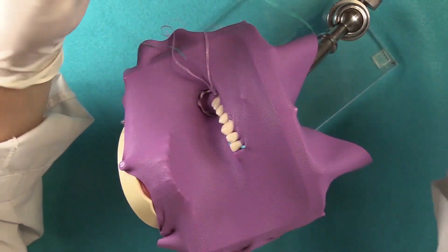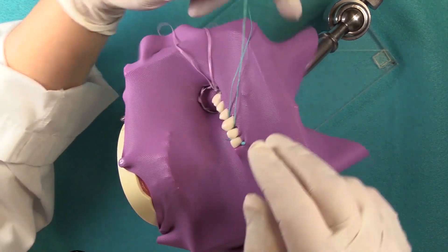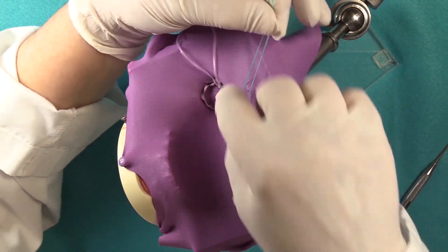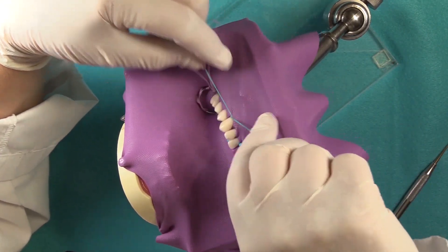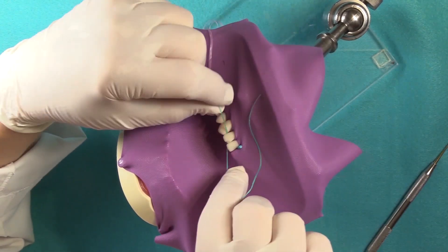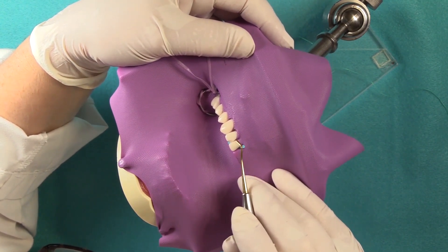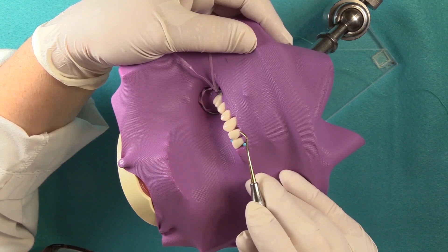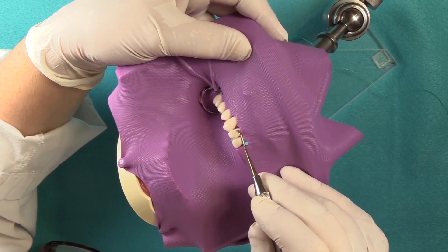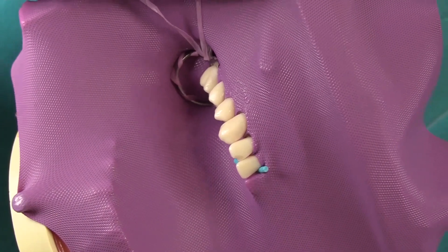If I run into difficulty with inversion still, there's another technique where you can use some dental floss — you're going to wrap it around the tooth surface like this. You're going to tuck the material down on the lingual and cross the floss on the facial, gently tucking it, and come back out and go on to the next tooth. Even I'm not perfect — my hole size: I should have punched a smaller hole in the non-latex dental dam. You can see right here where this is not going to invert very well, because I punched the hole too large.